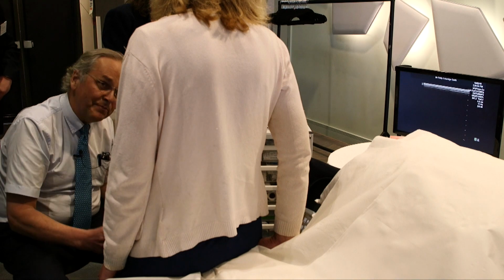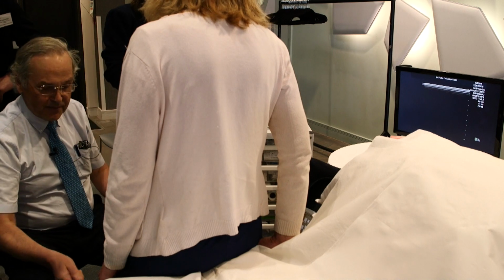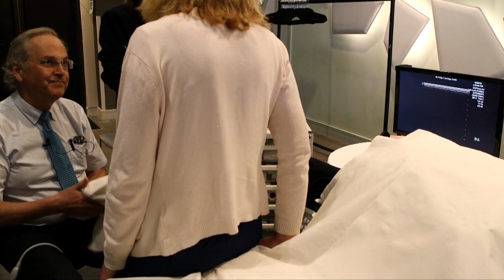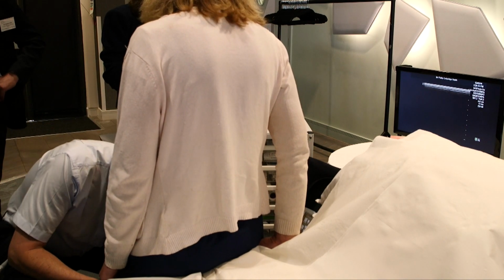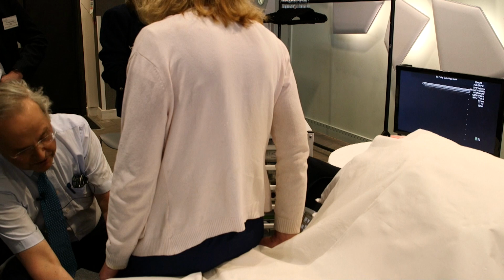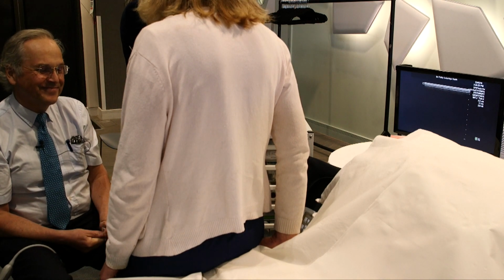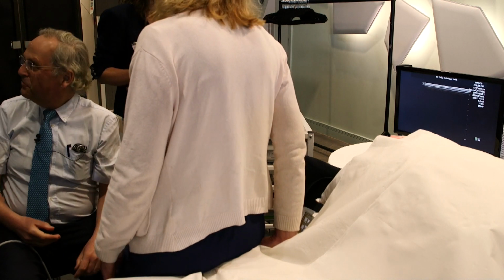So what I plan to do is inject local anaesthetic here, here, here and here approximately, and here. And we'll pop a little intravenous cannula in those places and put some foam in. And that should fix it. So the aim of today's treatment is to fill every single varicose vein in your leg with sclerosant foam. So we instantly cure everything. I think we should begin. You okay? You clear what I'm trying to do?